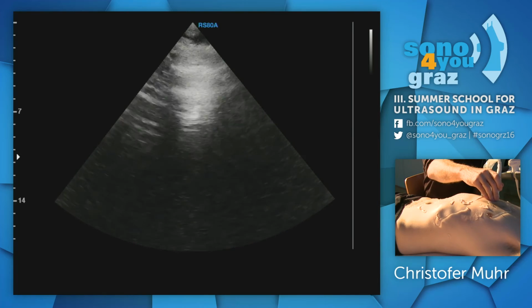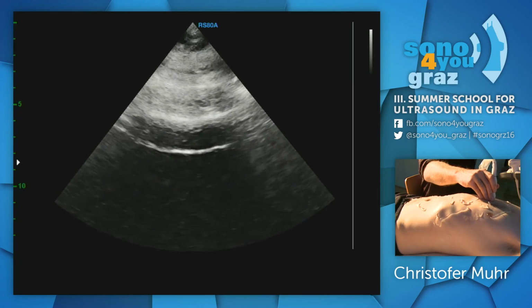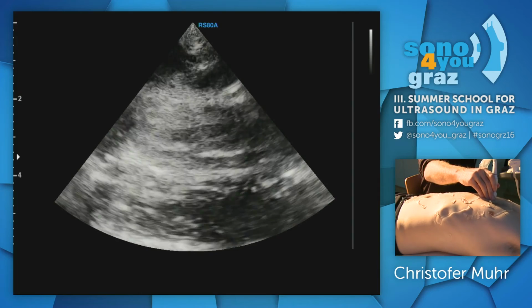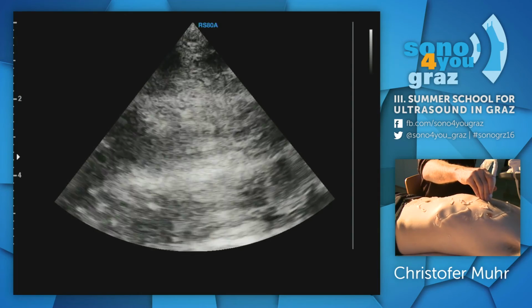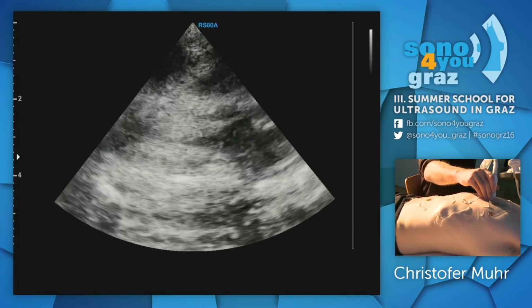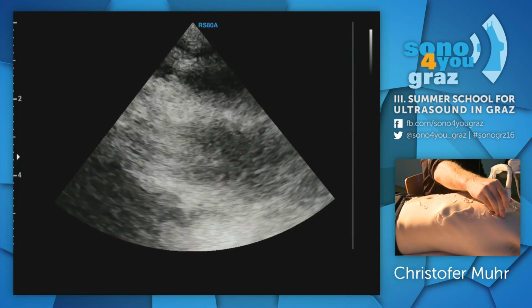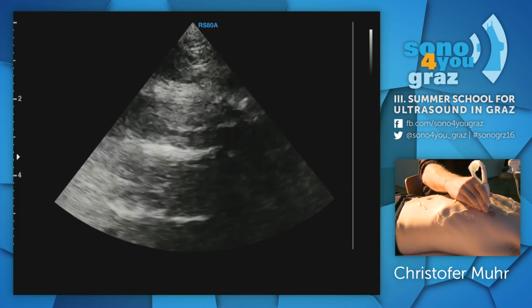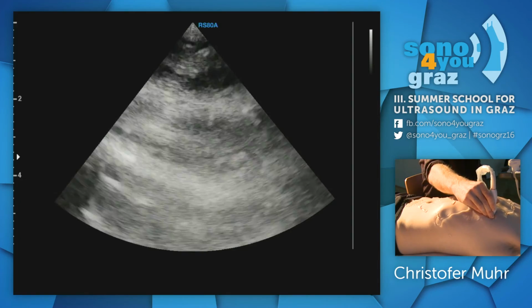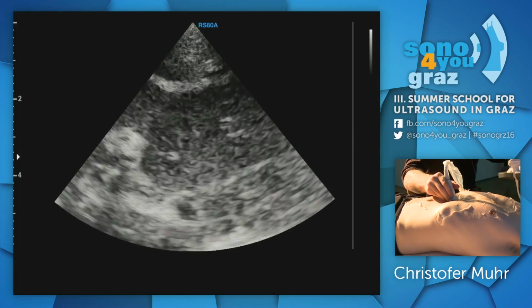And now take a couple of deep breaths for me. Okay, so I see lung sliding here. Does everyone see it? No, you're not happy with it? Oh, beautiful lung sliding here, no? You don't think so? They're hard, huh?